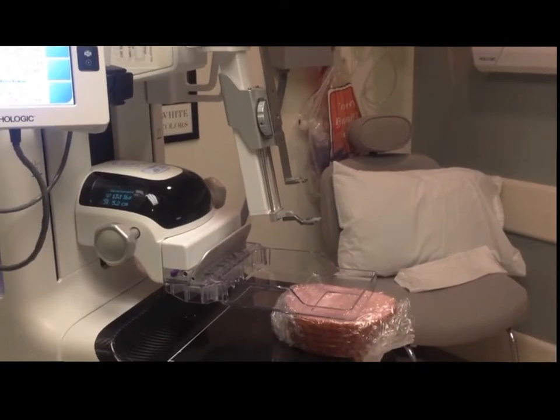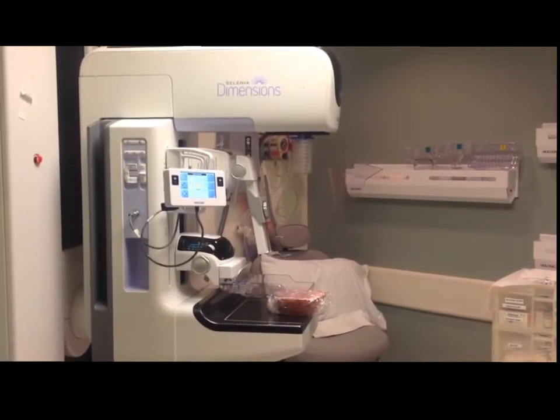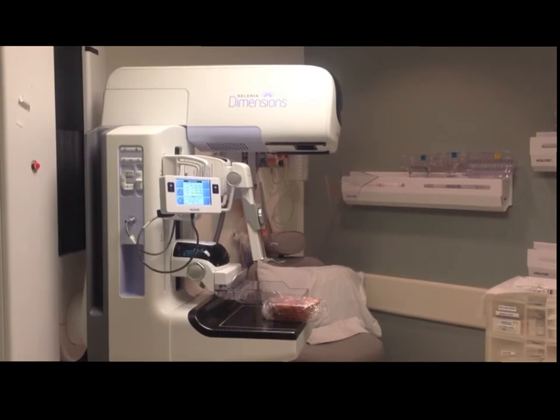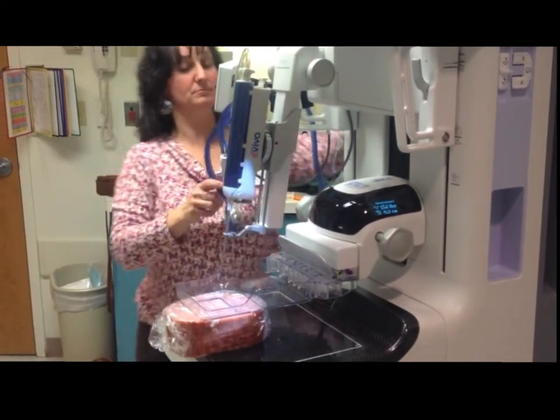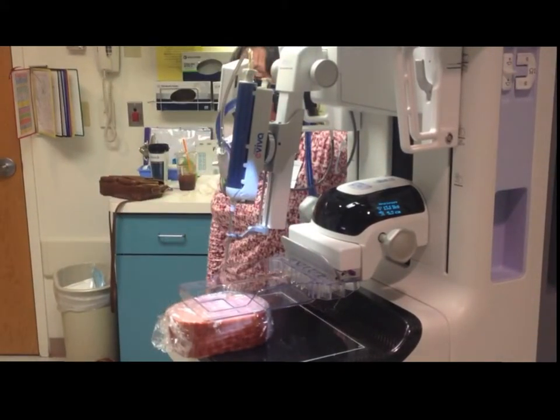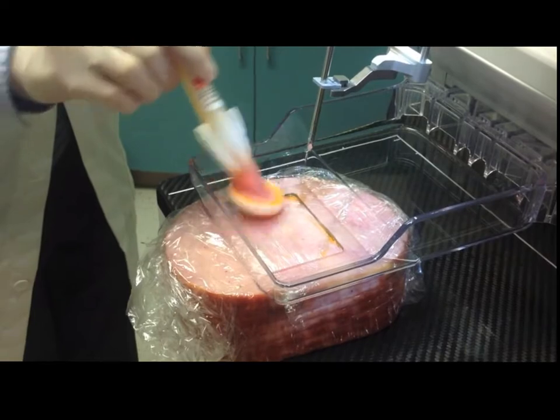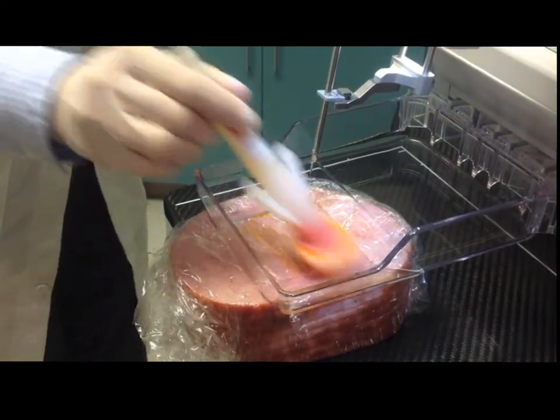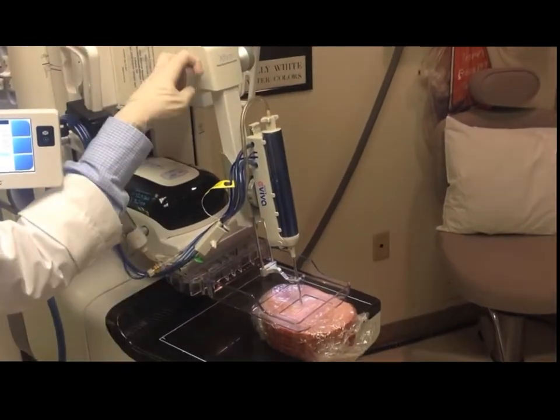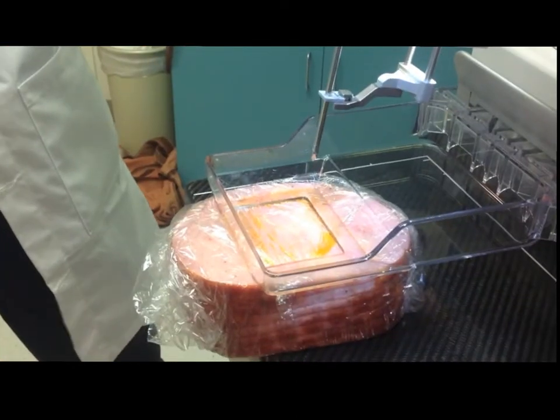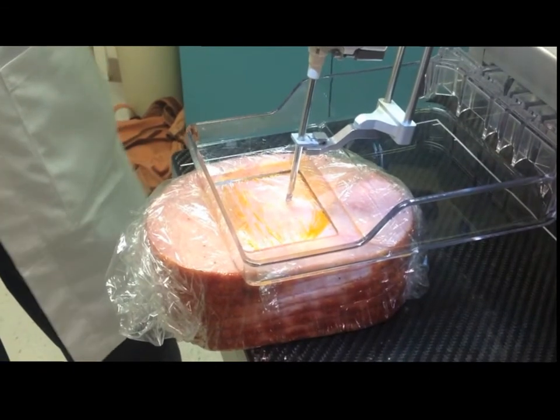After the gantry has been moved to the correct position you then want to get the technologist to swing the camera arm out of the way for her to be able to get the needle into position. It won't slide on if that camera is directly ahead of it. Once we're at this stage we're then ready to start with preparing the patient's skin so clean it thoroughly. We use chlorhexidine solution and then wind the needle down until it's very close to the patient's skin surface. You can see here that will help you identify the exact spot where you need to apply the local anesthesia.